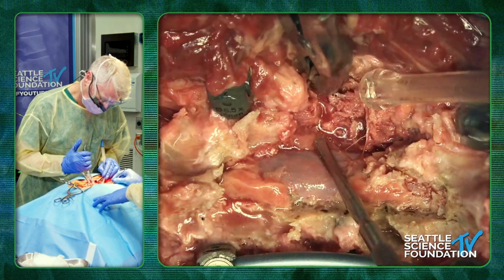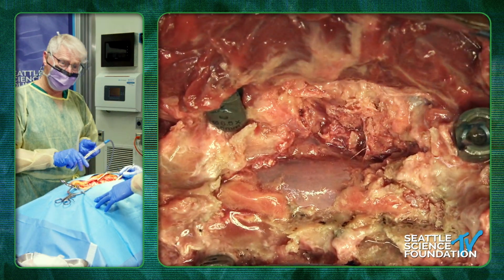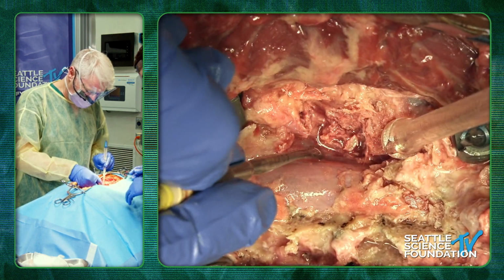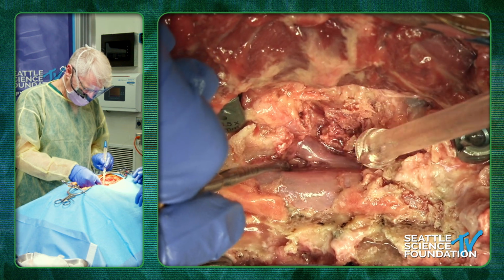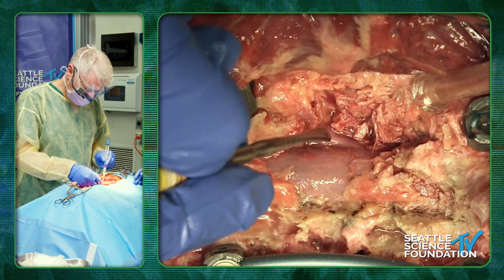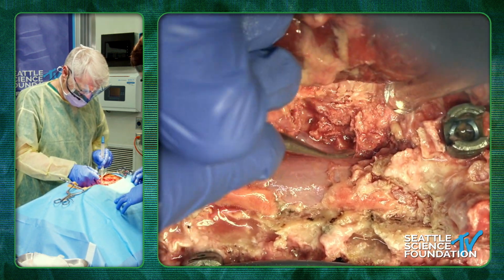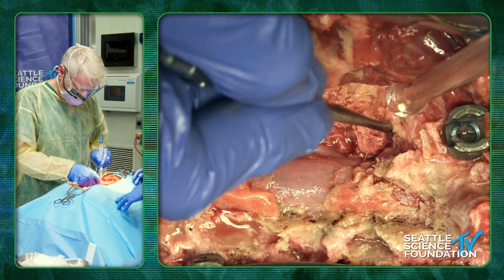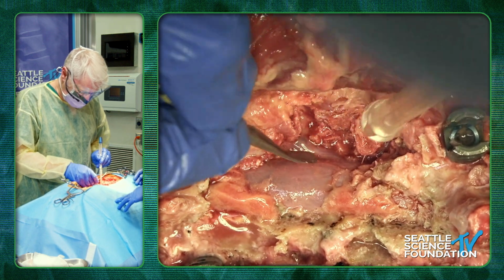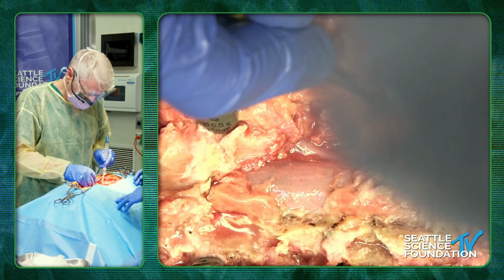So what we have now is the pedicle separated. So you can see here, maybe, Colin, you have a better position because my head blocks it all the time. So we have the nerve root here isolated. Does that show up nicely? Yes, it shows. Okay, and you can see the pedicle isolated here, and we still have the top of the pedicle here still available. So this is the inferior facet, superior facet's removed now, and now we have basically an isolated pedicle and the nerve root. So we've separated the transverse process off.